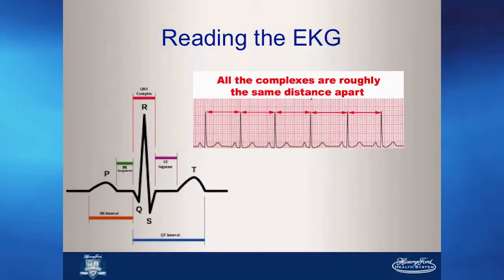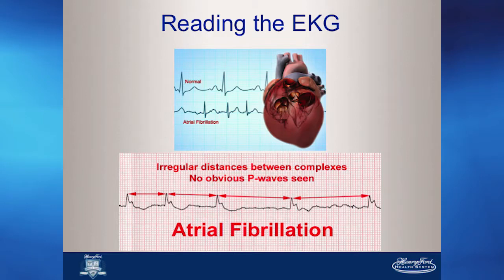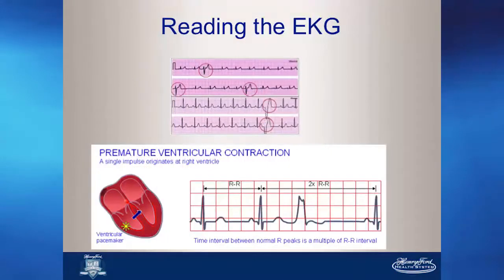So when the patient's brought into the room, they are hooked up to the EKG, and we've trained our techs to look at the EKG, to look at normal rhythm, AFib, PVCs, to try to determine how we're going to get the best scan possible. When we have problems with the heart rate, that's where we run into problems with the scanning. And fortunately, on our scanners, we are able to edit the EKG strip so we can get better images. And it works most of the time.